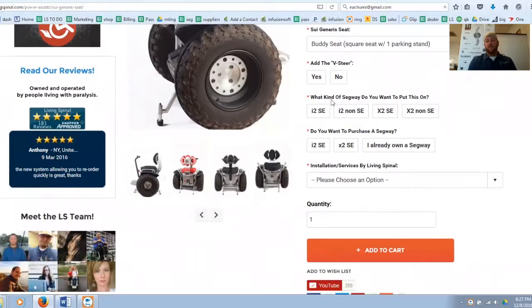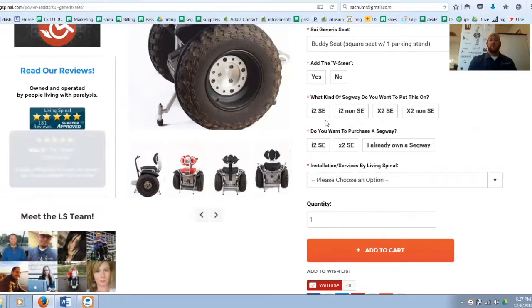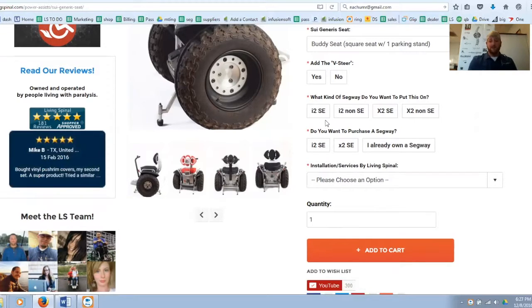The next thing we've got is we need to decide what kind of Segway you're going to put this on, whether it's an I2 or an X2. And then we have to look at whether the I2 or X2 is a non-SE model or an SE model. About 2 years ago, Segway stopped making non-SE models, and they came out with a new one called an SE model. So all of your newer Segways in the market that you purchase today are going to be SE models, and all of the older ones out there are going to be non-SE.